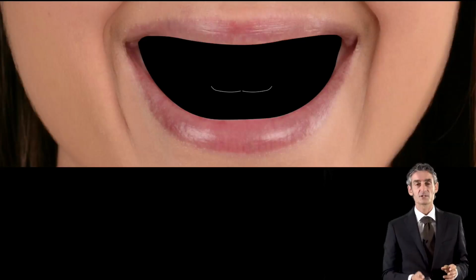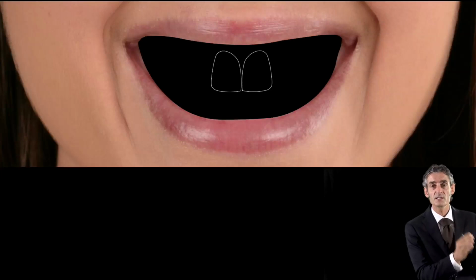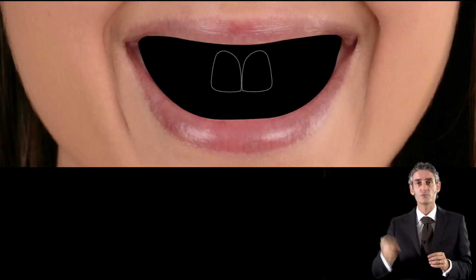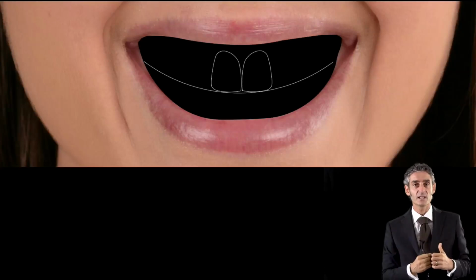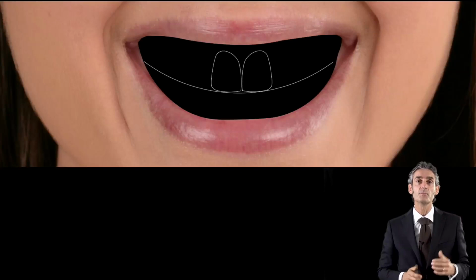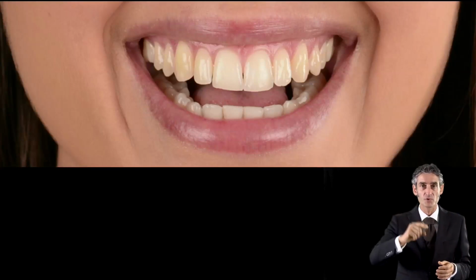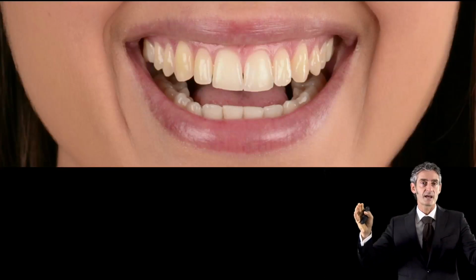After we locate the incisal edge of the central incisor, we have to create with the proportion of the teeth, so between 75 to 80% between width and height, and then we locate the future free gingival margin, the ideal future free gingival margin. Then, understanding the orientation of the occlusal plane and the vertical dimension, we will be able to create the perfect smile for the patient. So first we have to locate the incisal edge of the central incisor, then proportion, the future free gingival margin, occlusal plane, vertical dimension, and then we can set everything.